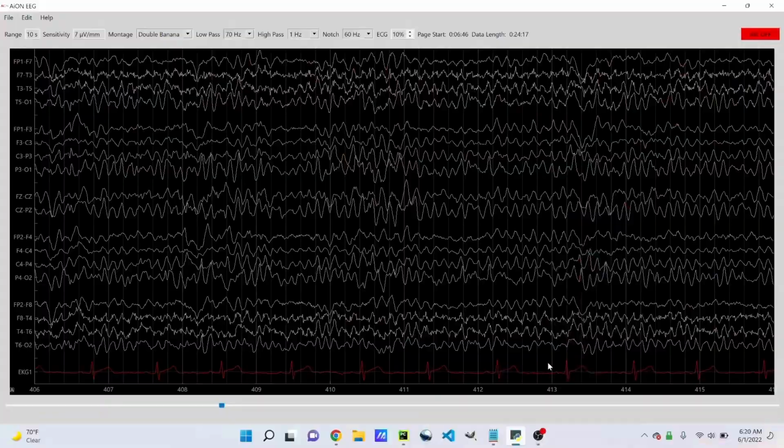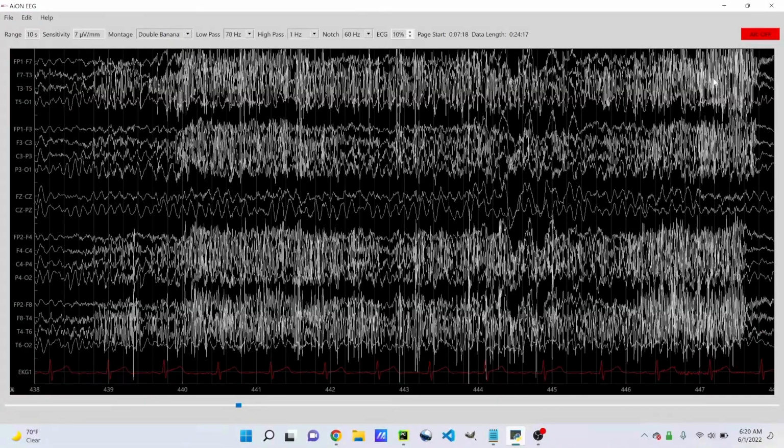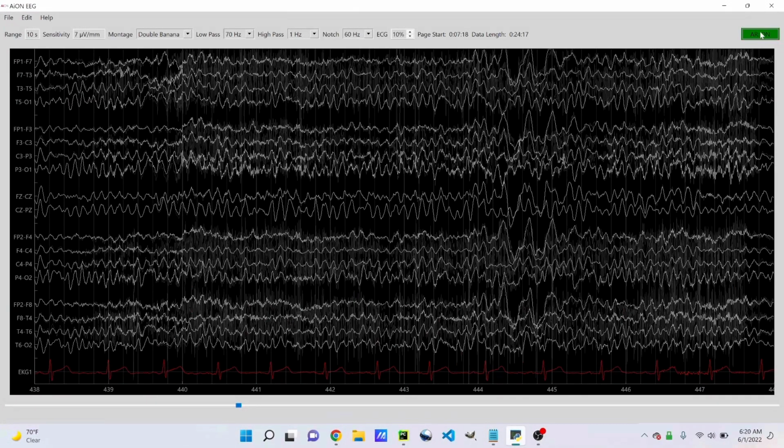Now, if you're unfamiliar with me, I work in the hospital as an EEG technologist. An EEG is just a patient's electrical brain activity, pretty much just their brain waves. So my medical device, the software that me, my brother, and my dad are making, is to read these brain waves and display them in the best way possible.